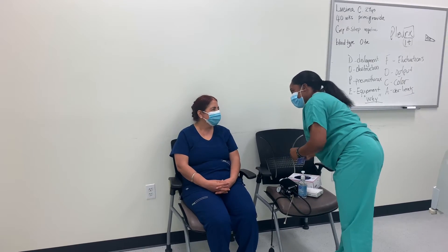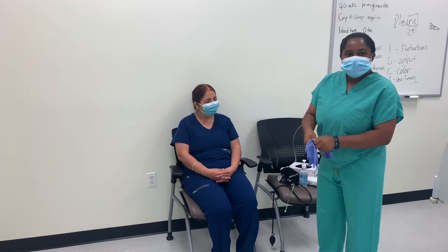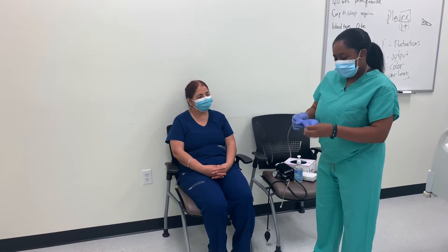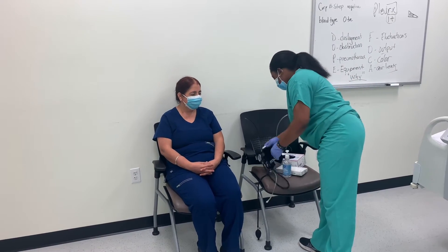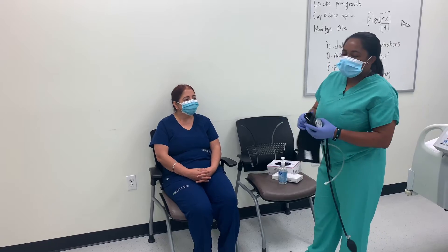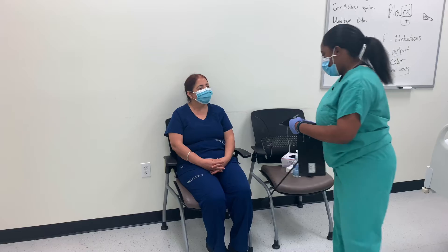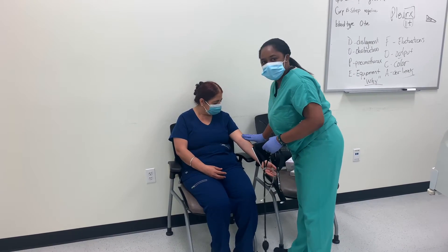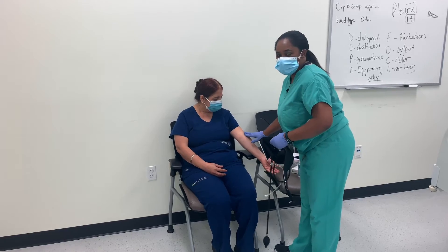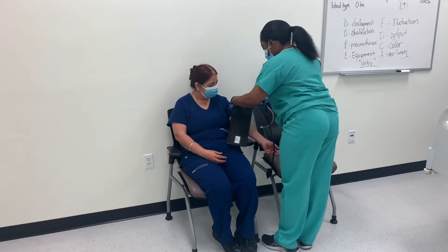I already know her sensation and pain level, because there are so many things that can affect a patient's blood pressure. It's really important to make sure that we have the right size cuff on the patient, and we know exactly where the brachial pulse is. We want to make sure that when you are putting on the cuff, it's not too tight and not too loose on the patient.